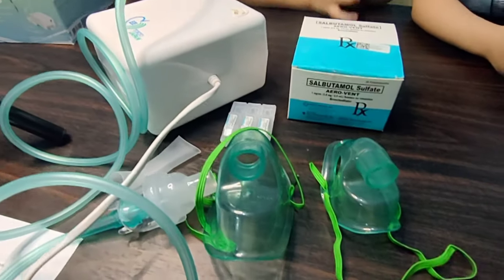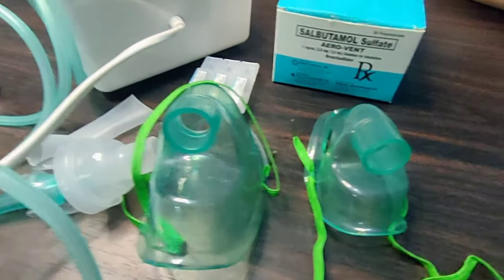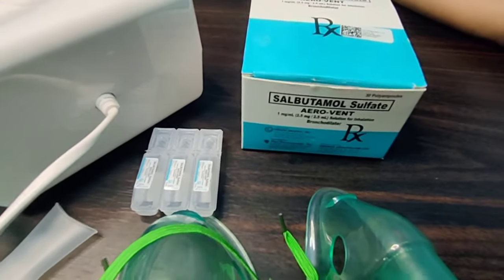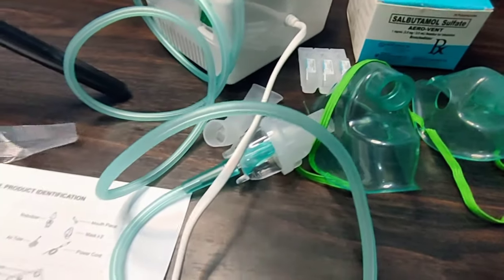So it comes with two types of masks — one for adults and one for kids — and there's the mouthpiece, the cord. Of course, this Salbutamol Sulfate Aerovent is not included in the package. Let's try it out.